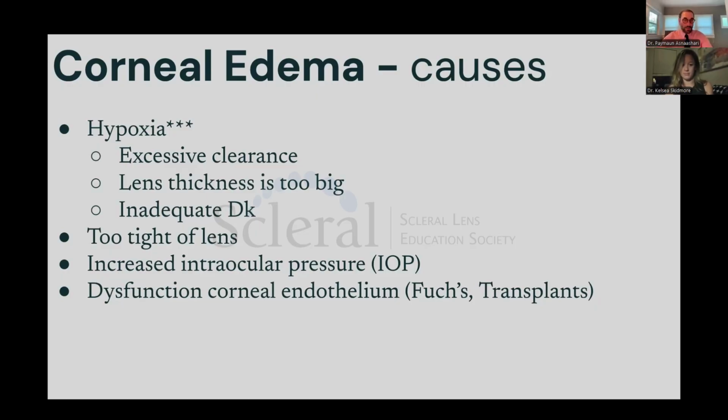Usually there have been some reports that the IOP could actually increase when you see signs of corneal edema from scleral lenses, so you want to check the IOP if you are suspicious of this. It also could be due to a dysfunctional corneal endothelium.